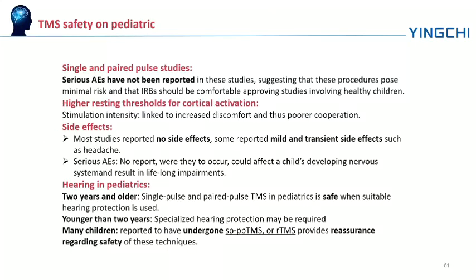So as for the safety in pediatrics, in many single and paired pulse studies, no serious AEs have been reported. And because kids may have a higher resting threshold for cortical activation, when applied with higher stimulation intensity, it may link to increased discomfort and thus poorer cooperation.